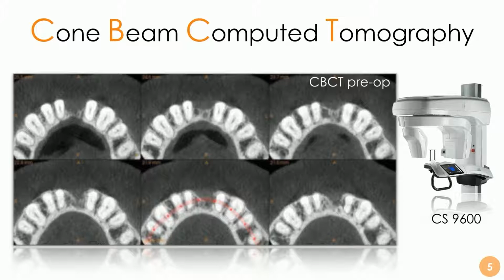We would like to place an implant after a long period with the patient wearing a Maryland bridge, and she wanted to replace the missing tooth in this case.